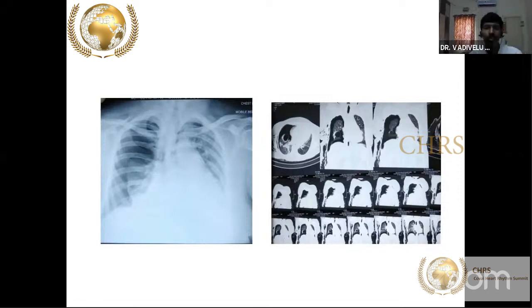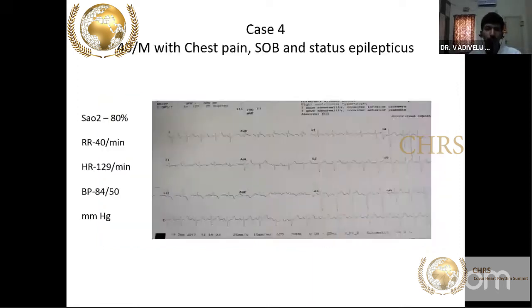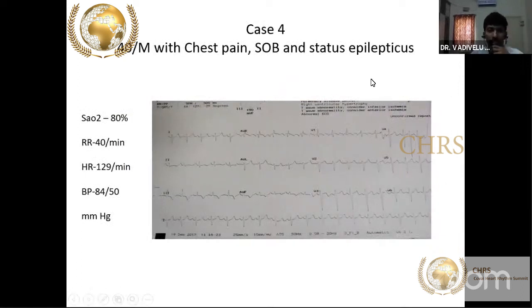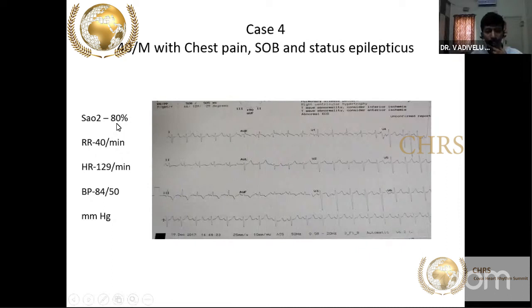Always do a quick clinical examination. If air entry is not good, suspect pulmonary conditions. A 40-year-old male with chest pain, shortness of breath, status epilepticus, respiratory rate of 40, oxygen saturation 80%, and hypotension who arrested at the emergency door. ECG shows sinus tachycardia — this is a case of acute massive pulmonary embolism.